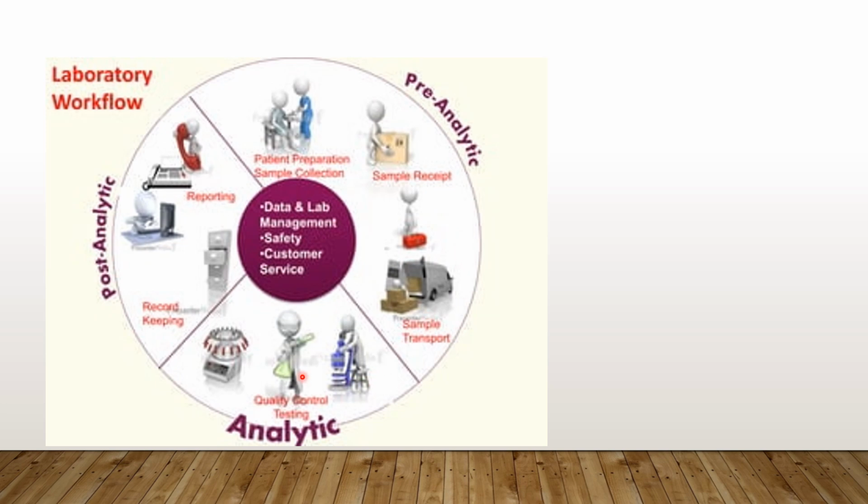Then in the analytical phase, there is quality control testing depending upon well established protocols in the literature. Whatever test we are performing, there should not be any shortcuts. We have to follow the proper procedure step by step, so that there are no chances of error.